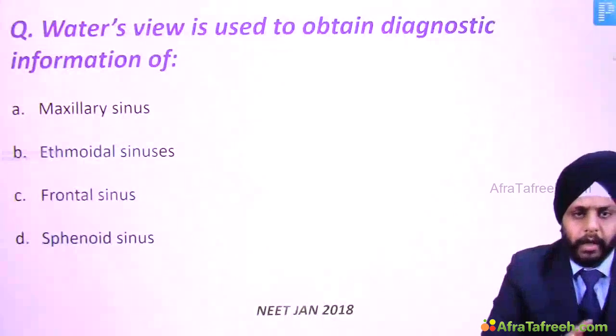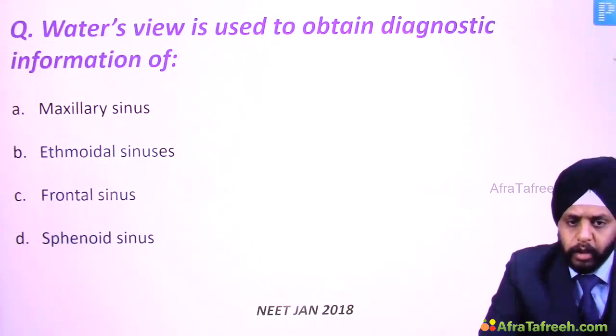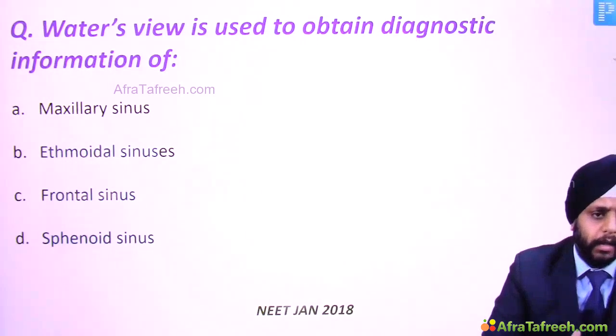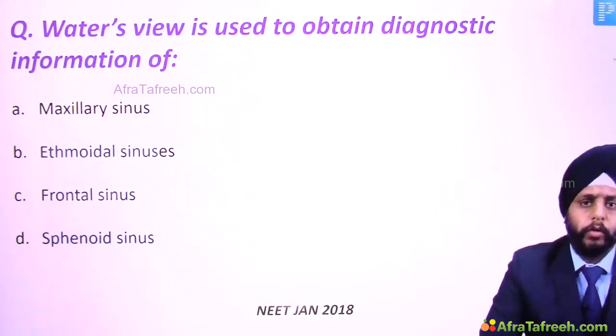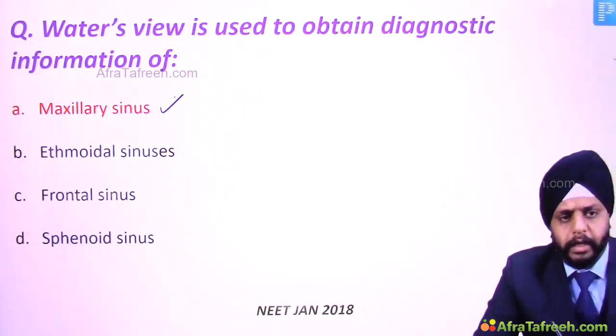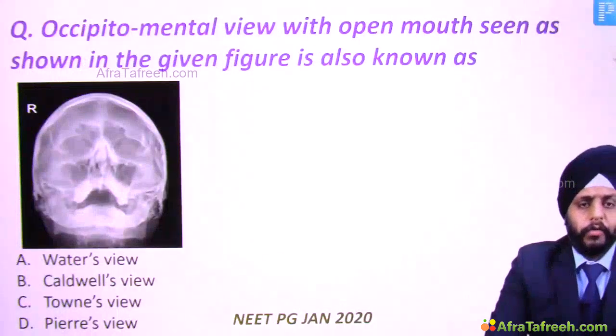Okay, now that's a question which was asked in the exam NEET January 2018. So as I told you, these questions are being repeatedly asked in the exams. Waters view is used to obtain diagnostic information of, and we know that the best answer for us is maxillary sinus. So mainly it is for maxillary sinus. Okay, let's look at another question.